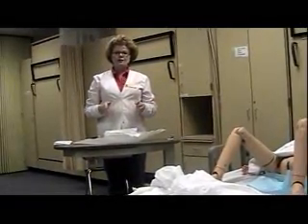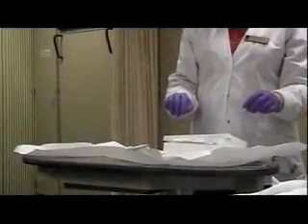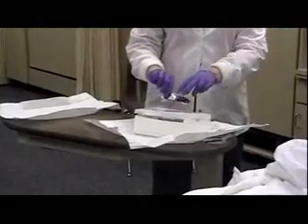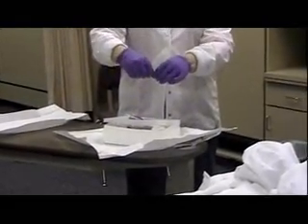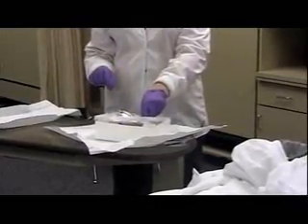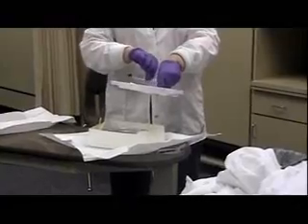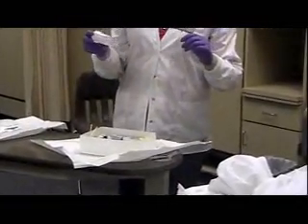Now I am ready to touch the supplies in my Foley catheter kit, so I need to put on my sterile gloves — please see the sterile gloving video. To make things easier, I try to get everything ready and put it in one box. I will open up my betadine swabs, open my KY jelly, and I have my syringe here with water for the retention catheter. I will take these out of the package and put them down into the box. The specimen label does not need to be sterile and can be set aside.